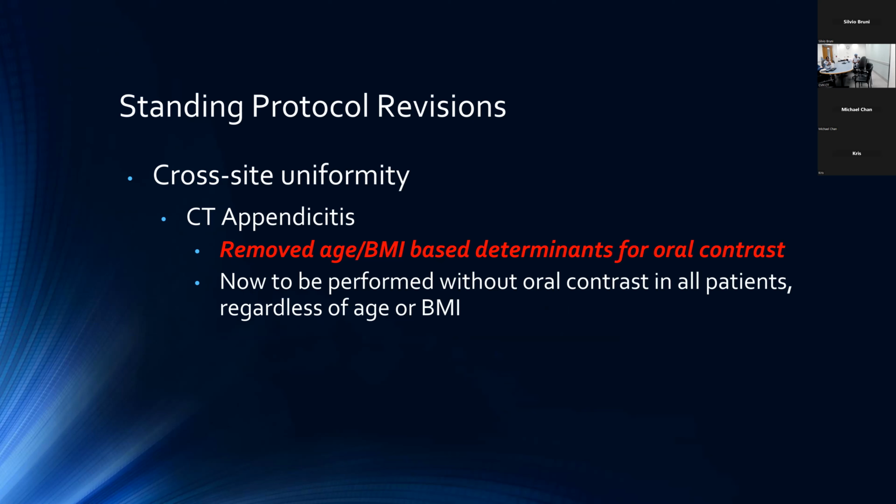I think probably in the near term, we'll revisit oral contrast use as a whole in the ED population, and may potentially expand those indications where we are not using oral contrast. But that requires a little bit further discussion. So we'll revisit that, and we'll keep you apprised of any additional changes in that regard.